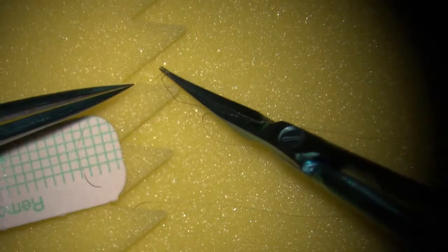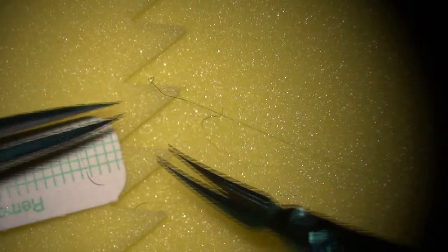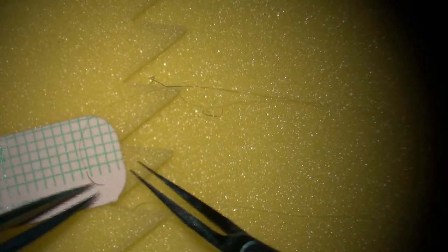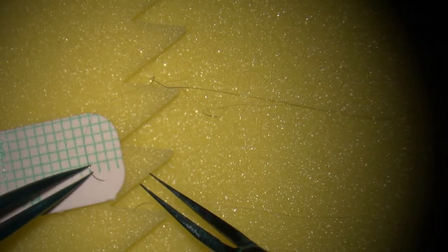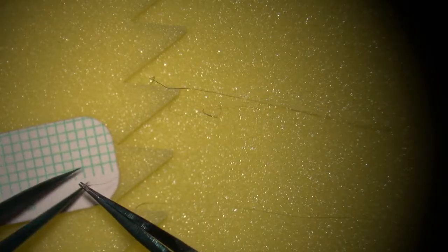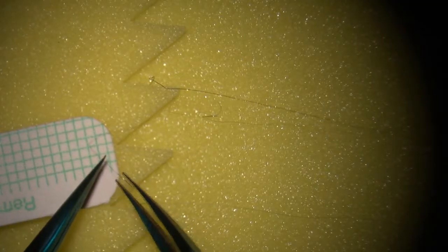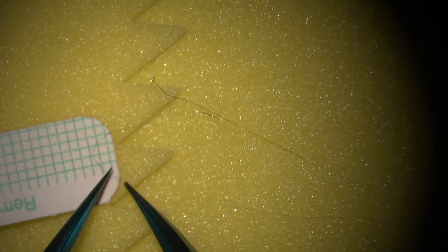Did you practice handling the suture before? The only experience I had of microsurgery was during the trip to Egypt. For about 15 minutes, I went under the microscope. But that was my first time suturing ever. Oh, yeah. Try this smallest needle in the U.S., and you use the finest instrument also. The needle holder in your hand is $1,500. Wow, and it's super microsurgery, correct? Yeah.